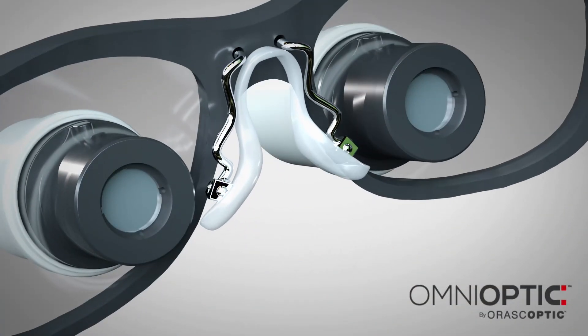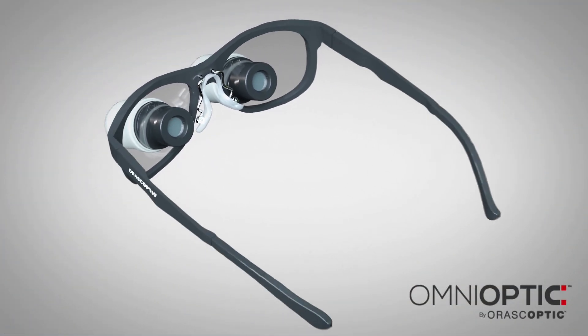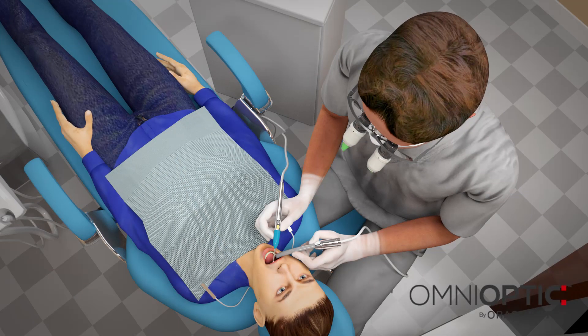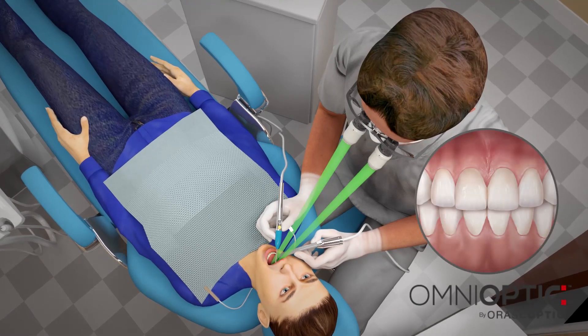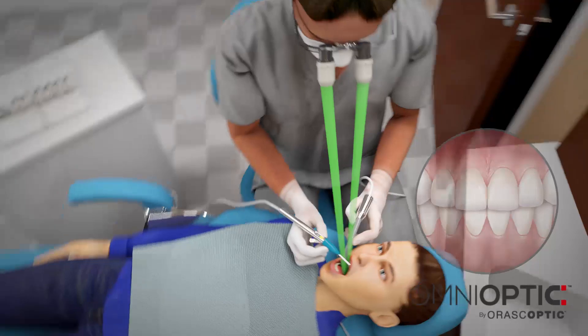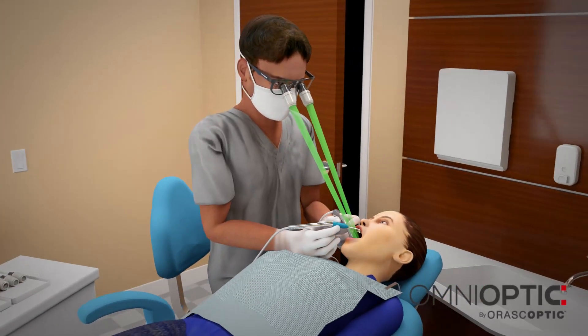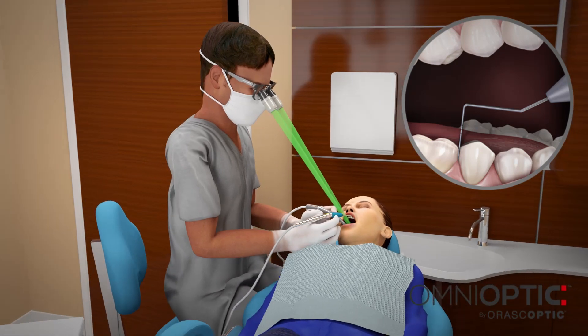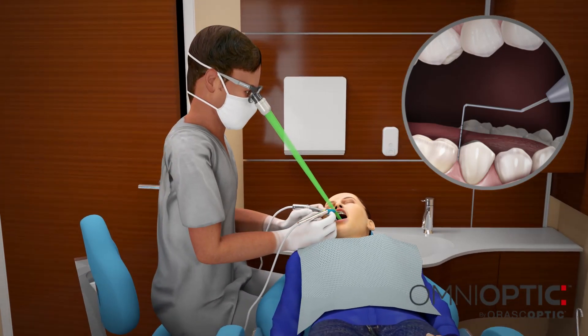Adjustable nose pad and temple tips provide customizable comfort. Omnioptic delivers a crisp image with edge-to-edge clarity and an optimal field width and depth for any healthcare professional. An individually customized working distance and steep declination angle may help reduce head tilt and improve overall ergonomics.